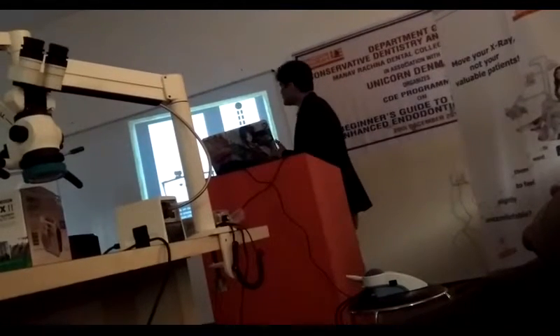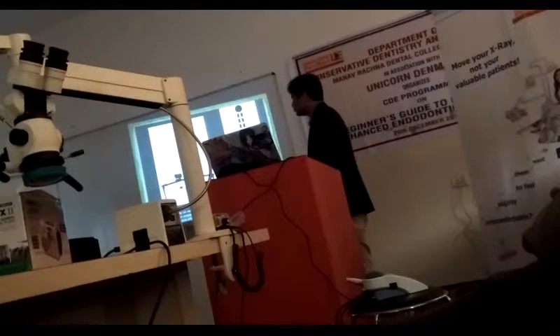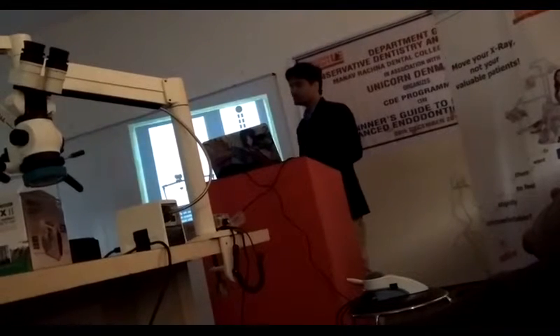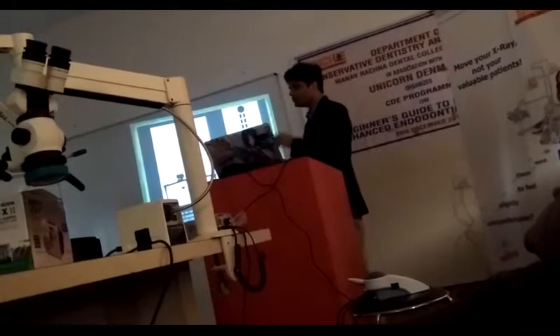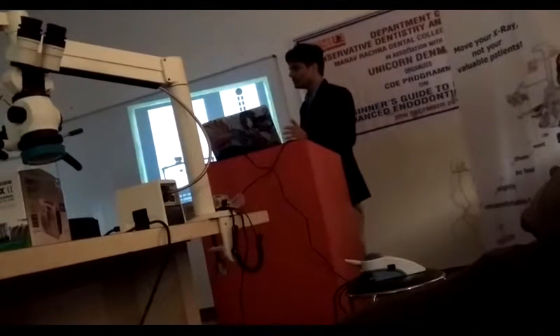When your eyes become strained, over a period of time you will feel extreme fatigue. Suppose you are doing a root canal with loupes and there is extreme calcification, you are removing denticles, you are negotiating the canal for say 1 hour, you will feel extremely exhausted and tired. You will just want to throw the loupes away and sit and relax in a very harmonious way. But there is no way to get that.